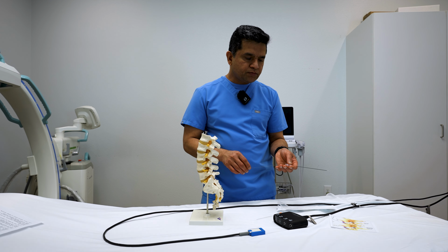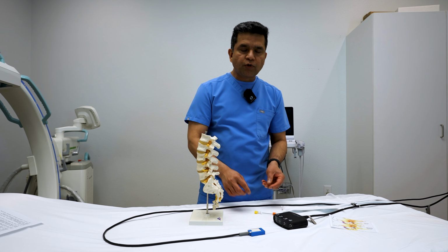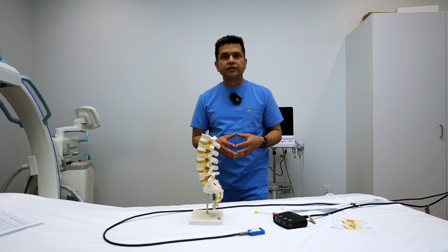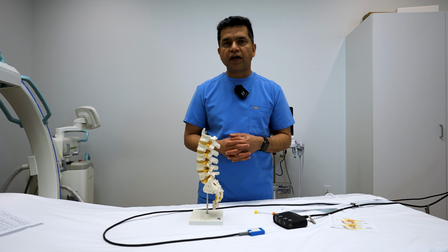And then we are able to test for sensory and motor to make sure we are placing the radiofrequency probes in the right place. And subsequently, we deepen the anesthesia once the testing is done. So altogether, it's a little lengthier procedure. It can take about 35–40 minutes, depending on how long it takes to get the IV, things like that.